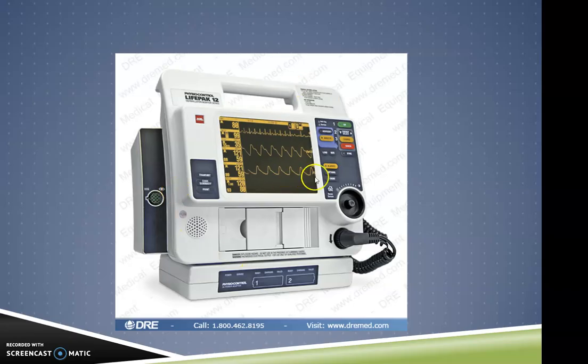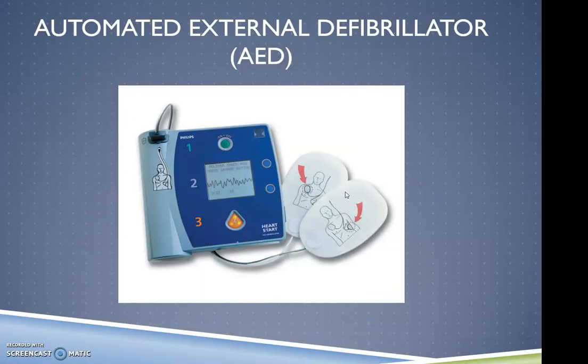Once again, another picture, you might be able to see the buttons a little bit better. If you zoom in, you can see we have an energy select to select the energy that we want to shock with. We have a charge, so we can charge the device. This is our sync button, and then this is our shock button. I talked about the AED. You are all trained how to use the AED in your CPR class.